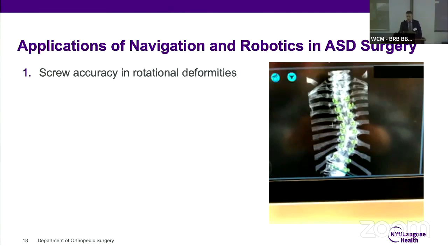What that means is I let medical students put in pedicle screws now, and I have no stress because I can see what they're doing. I can see on the screen what's happening. And if I think something's not going right, the computer and the feel of what's going on will tell me, and I can intervene and make sure that the screw goes in the right place.